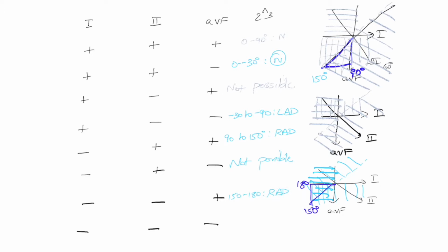Now let's get the last scenario, and then we've mastered how to interpret a ventricular depolarization axis. So we have leads 1, 2, AVF, and we've said 1 is negative, so it's somewhere here. We've also said 2 is negative, so we have the imaginary line, and we said 2 is negative.